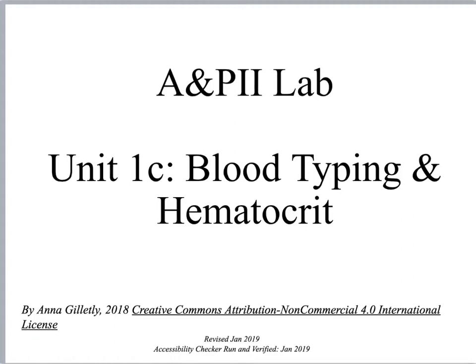Hello, I am Anna and I am going to be going over part C of unit 1. This particular video is going to look a little bit at blood typing and then very briefly at the hematocrit.